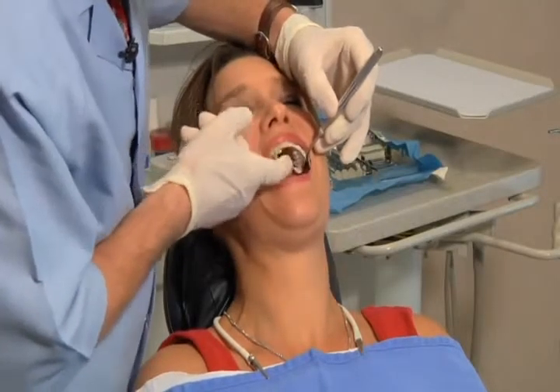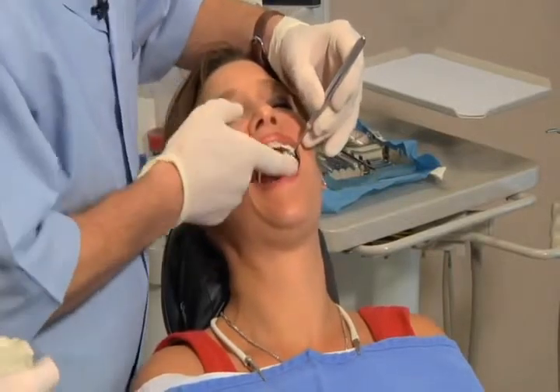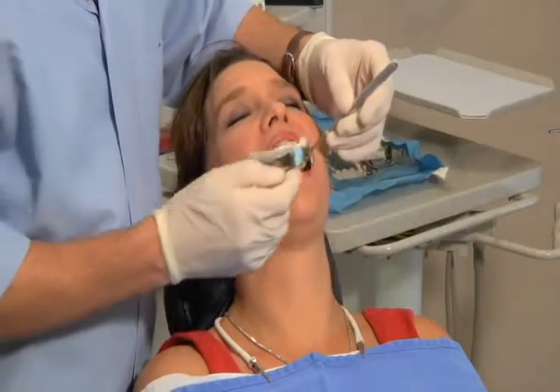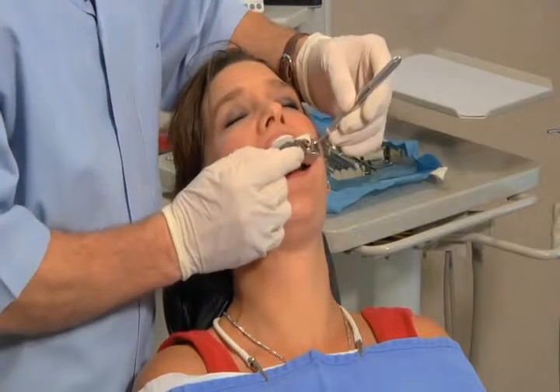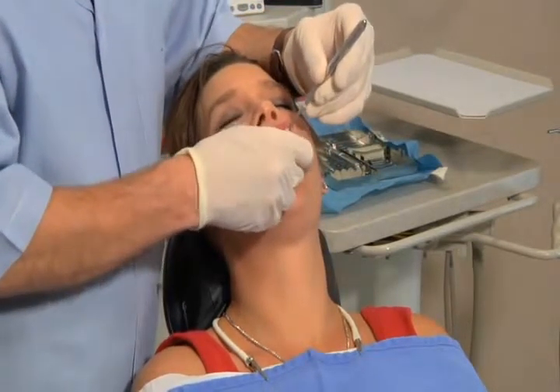Step five is to wipe a little bit of alginate on the occlusal surfaces of the teeth. This is important to keep bubbles from forming on the occlusal surfaces. Step six is to use a mirror to retract the cheek — you'll have way more room to work with than if you use your finger, which takes up all the space.